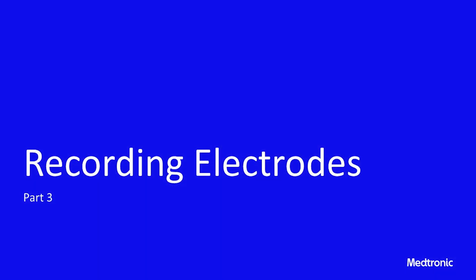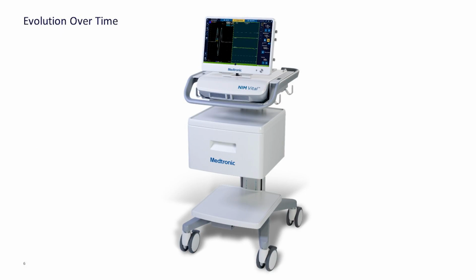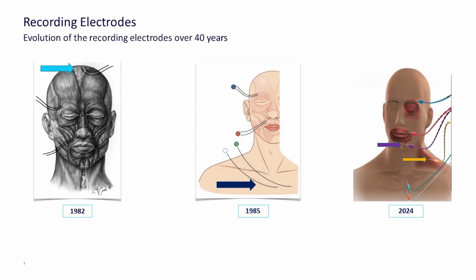Today we'll focus on a new recording electrode montage to make monitoring safer and more effective. Over the last 40 years, facial nerve monitoring has become an important adjunct to reduce the risk of iatrogenic facial nerve injury. Over time, incremental changes are made to hardware and software, and now we strongly recommend a change in the recording electrode montage to improve efficacy and safety.